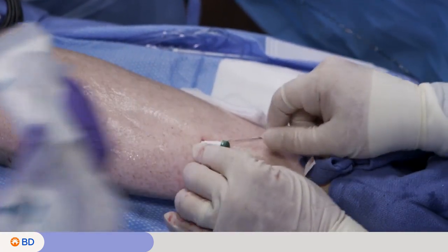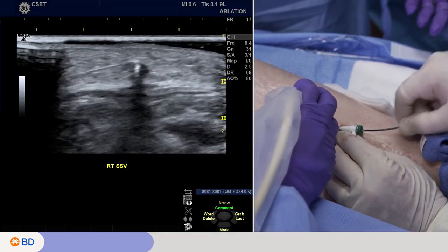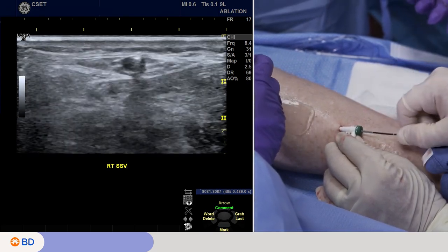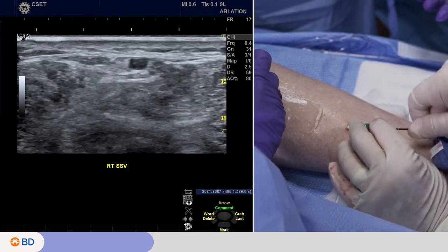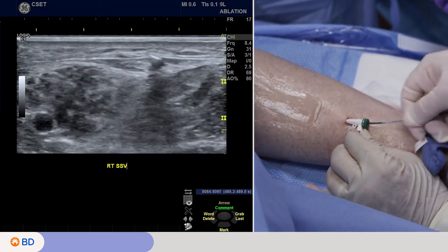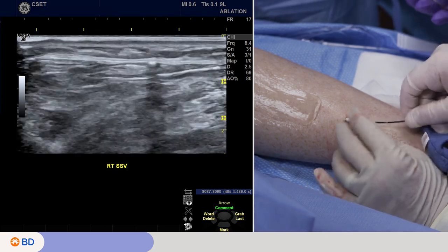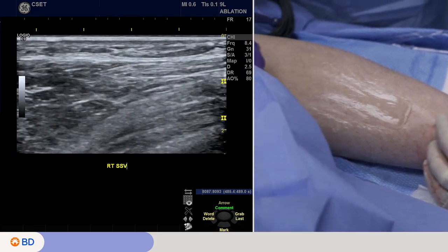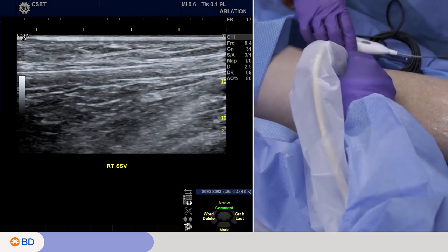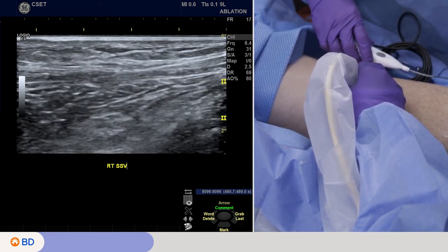We put the catheter into the vein and watch its transit on ultrasound. I'm feeling for resistance and I actually found some pretty early on, so I torqued the catheter because of its shape and it just nicely got past that resistance — which might have been a valve or a side branch. It slipped right past. It's important not to ram this through but to feel and have that tactile response so you know if there are any barriers to transmission.